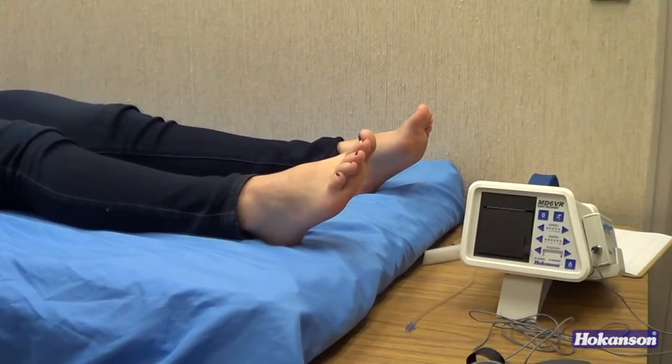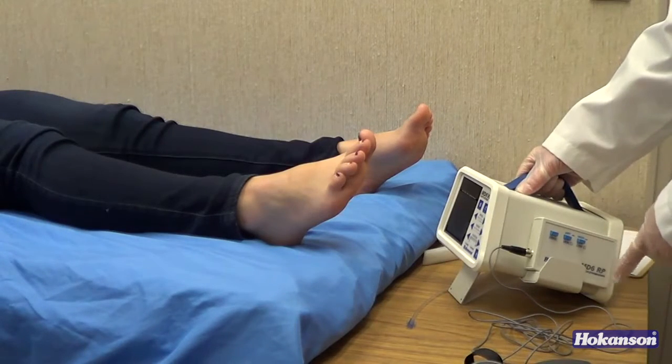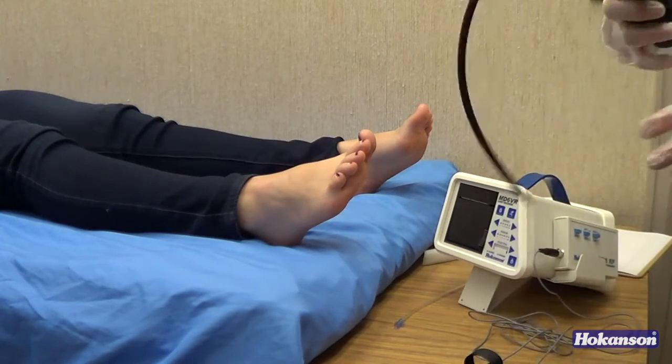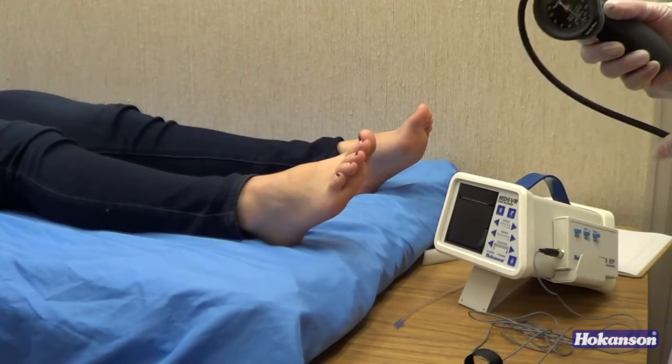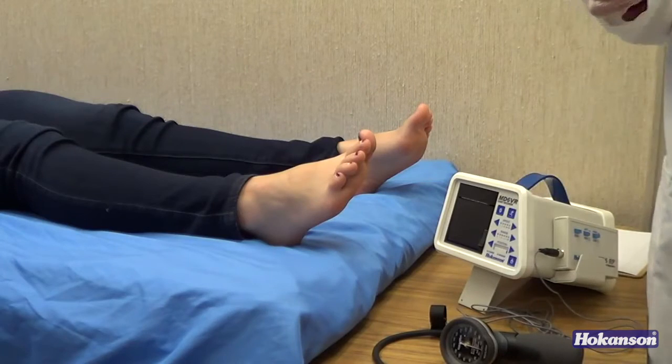This is a demonstration of a toe pressure taken with a Hokanson toe pressure kit. This is the MD6VR chart recorder with the MD6RP photoplethysmograph. We have an aneroid sphygmomanometer. This is the DS400 and a toe cuff.